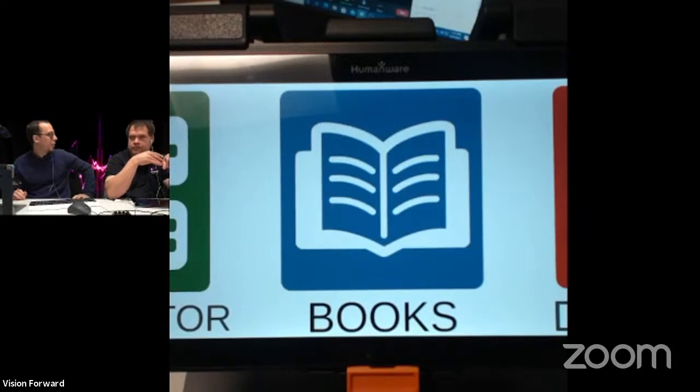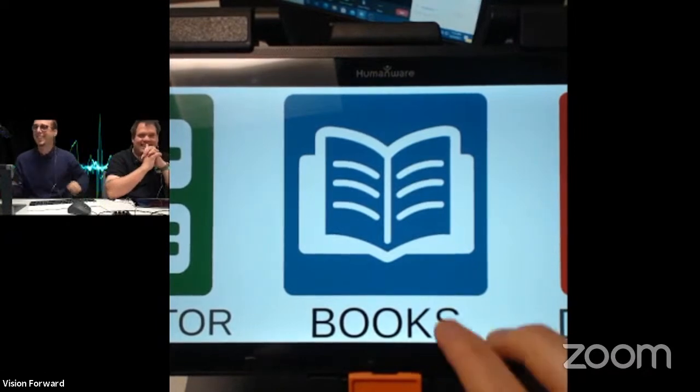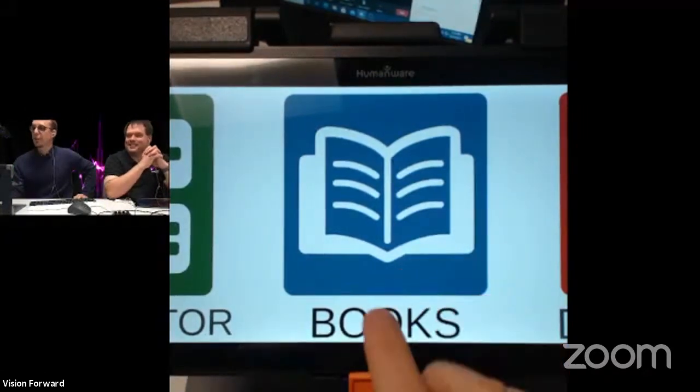How do you think they spell Prodigy? P-R-O-D-G-I. No, P-R-O-D-I-G-I. Exactly, yeah. So they have their own special spelling. Prodigy. There you go. So this is the Prodigy software.